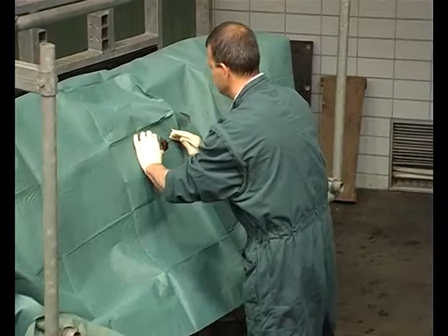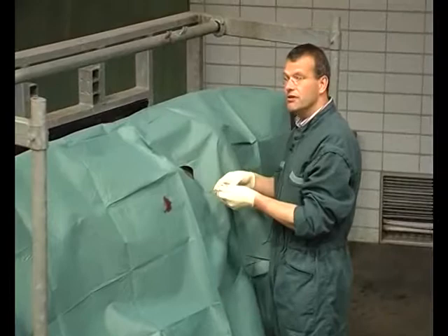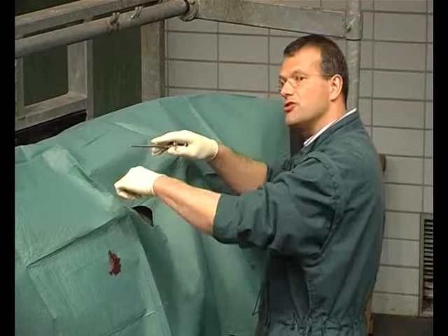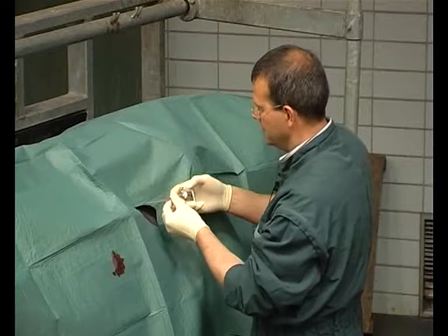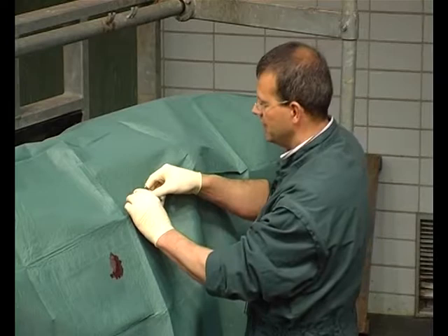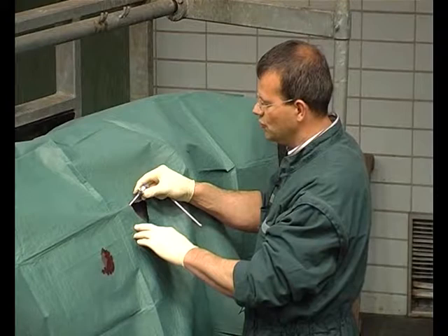If we have a very strongly dilated and dislocated abomasum, it's difficult to go in here with our toggle setting trocar to reach the abomasum on the top. So it's better to release a part of the gas of the abomasum. We can do that in the beginning with this 5 millimeter trocar, and I puncture the abdomen and the abomasum. I directly punctured the abomasum and release the part of the gas. Yeah, it's the smell of the abomasum. And now I slowly remove the trocar. Very slow.